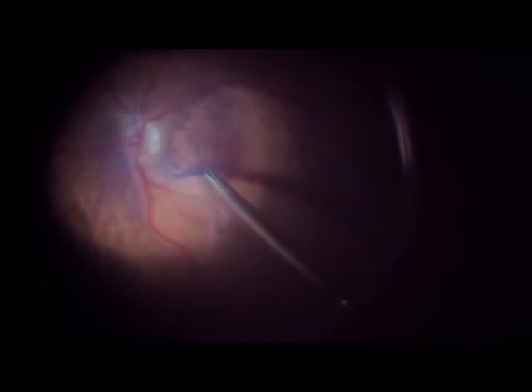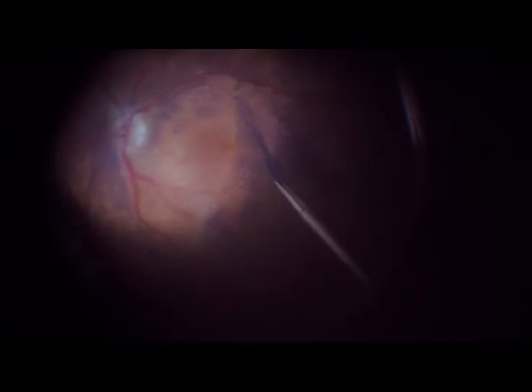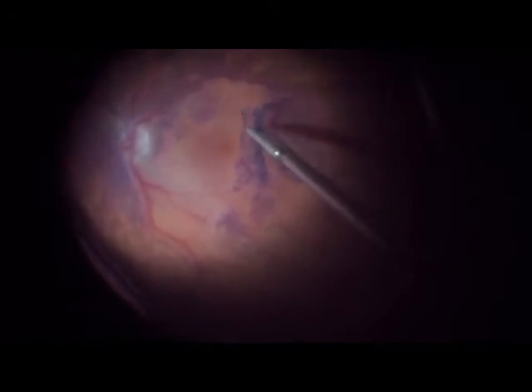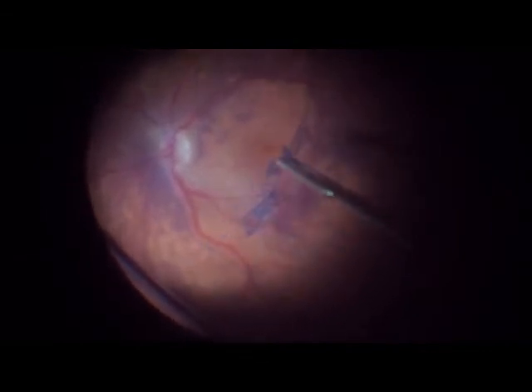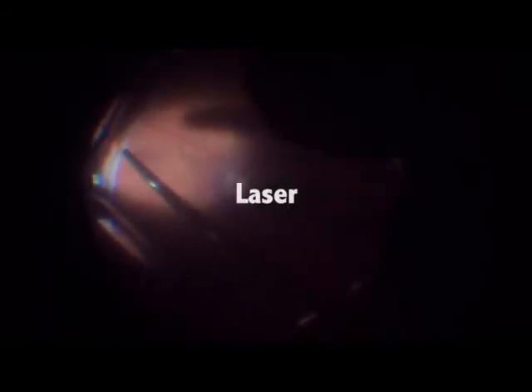It comes out softly, the tiny membrane, quite fluffy, and it's coming out in a gentle movement. As you can see, we are trying to get rid of the membranes that remain on the retinal periphery, freeing up the macula. We perform laser therapy right now to avoid retinal detachment, and then end the case with an air-fluid exchange.